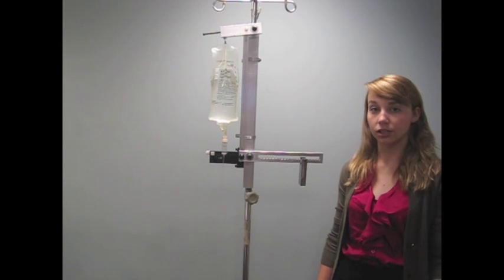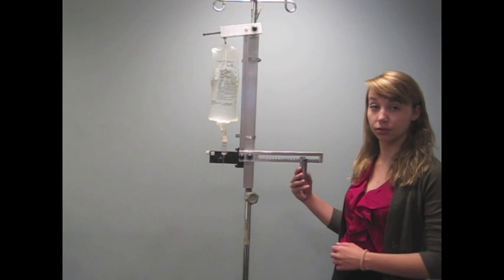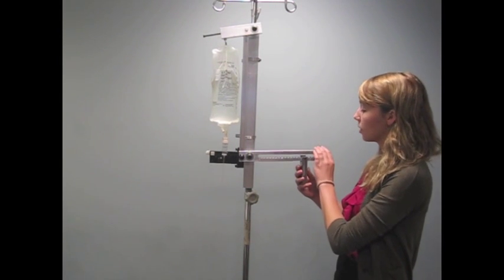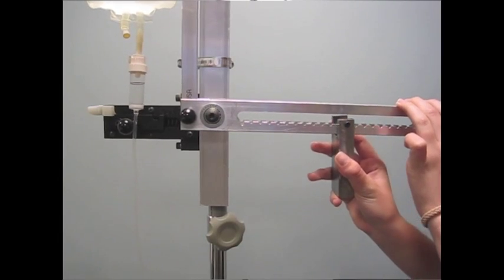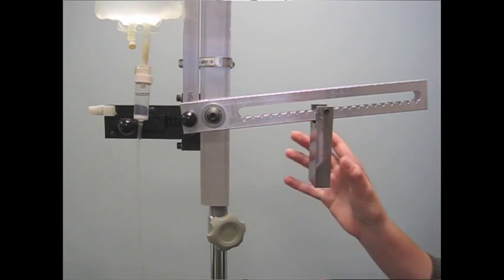And then, the clinician would move the counterweight one notch for each 50 milliliters of fluid she wishes to dispense. For instance, if you wanted to dispense 300 milliliters of fluid, you would move the counterweight inward six notches.